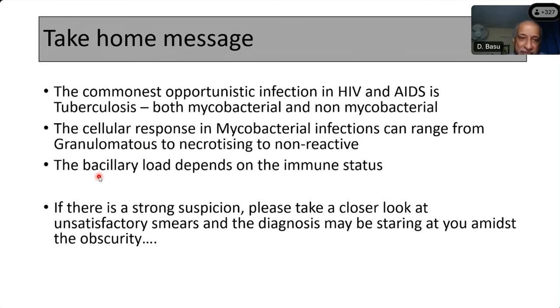Yes. So if there is a strong suspicion in a patient with suspected immunosuppression and infection, these smears are not really good. You do not get a good aspirate most of the time because there is so much necrosis and so much bacillary load. These aspirates are often unsatisfactory, but the diagnosis is there. It will be staring at you amidst all the unsatisfactory. So pay attention to these slides also, and you'll get your diagnosis. Right. So any other questions or queries?